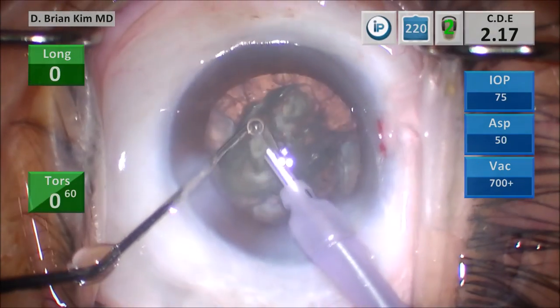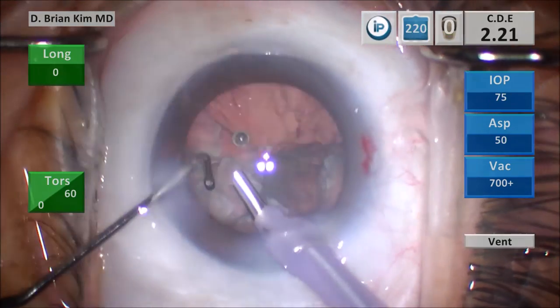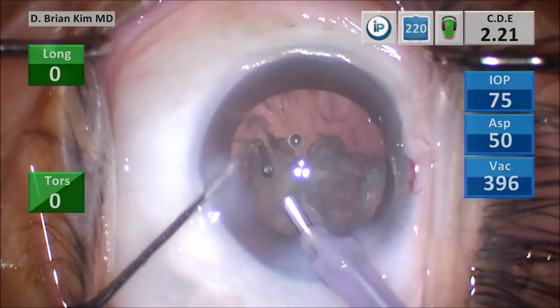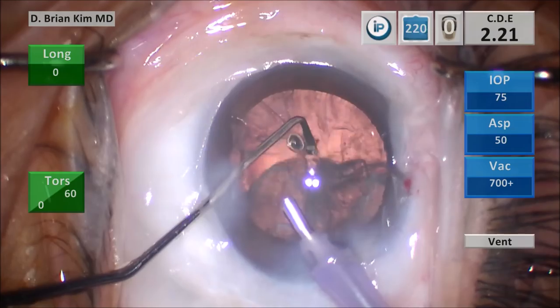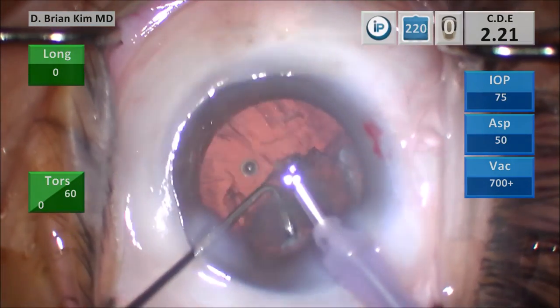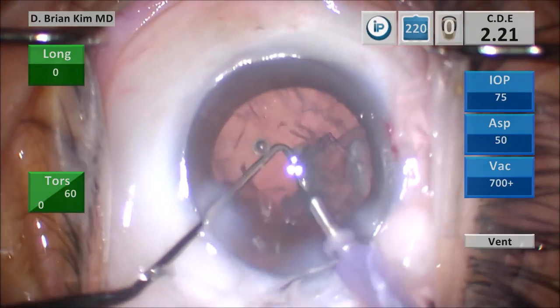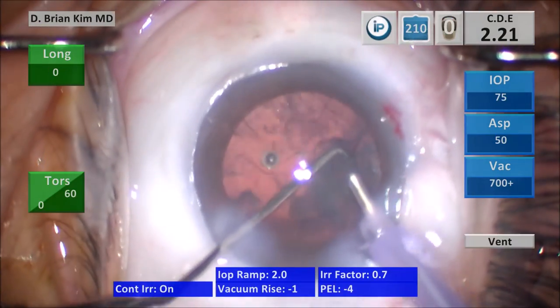At the end of the case I'm removing the epinuclear shell. I'm making sure I have the phaco tip somewhat superficial and the chopper is definitely deep in the bag when I do this maneuver, to make sure I don't break the bag during this manipulation. I'm using the chopper to manipulate that epinucleus in a very safe manner.